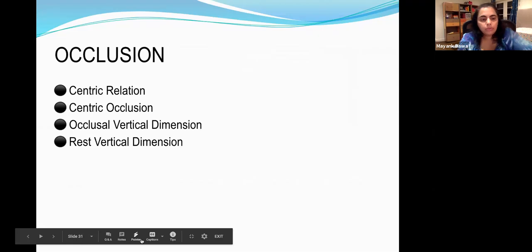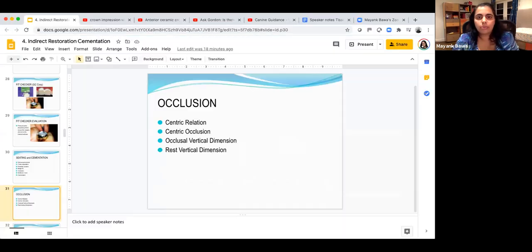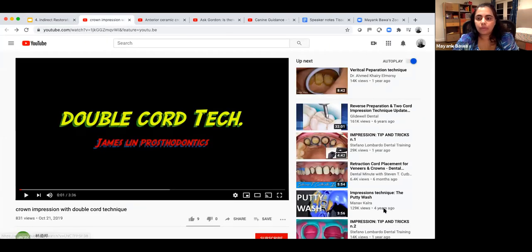Okay, so I'm going to share a couple of videos. First one, let's see the crown impression. These videos are going to be available for you in the Google Drive as well, but I just want to go over what we discussed before. So let me start this.